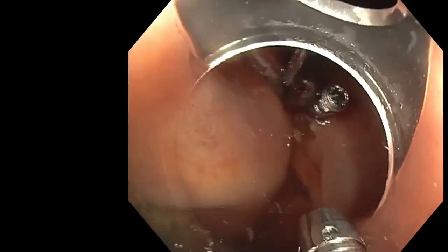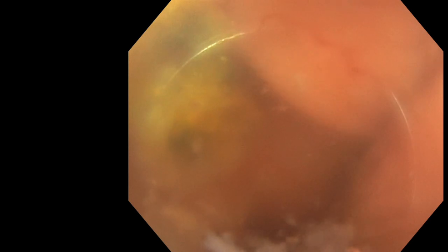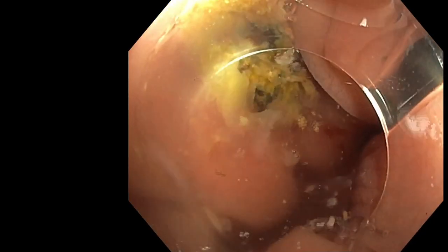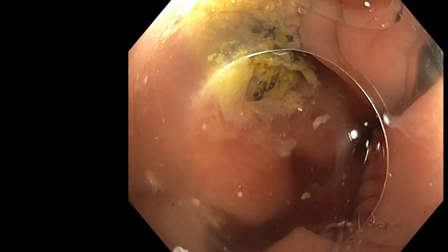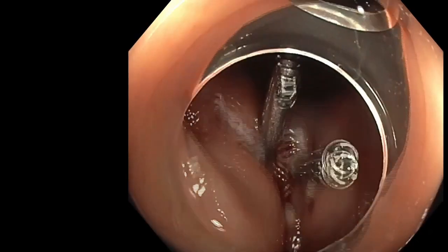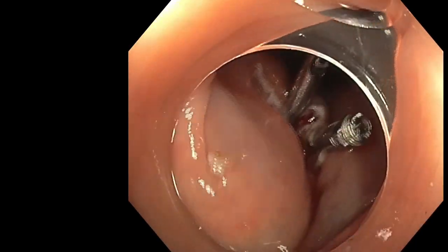The reloadable one is only 5 grams for the second one. Instead of using a new handle for each case, we have only one handle and reloadable clips from Creo Medical, which are reloadable, rotatable, reopenable. So it combines the advantages of single-use clips, but with a reloadable type of clip.